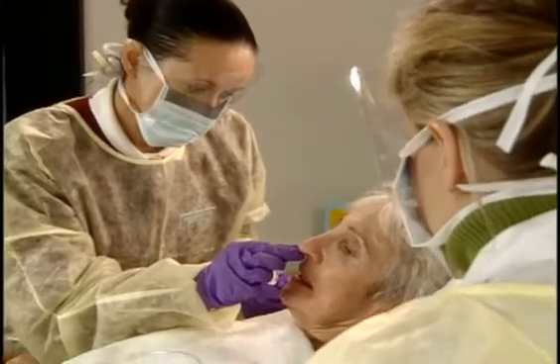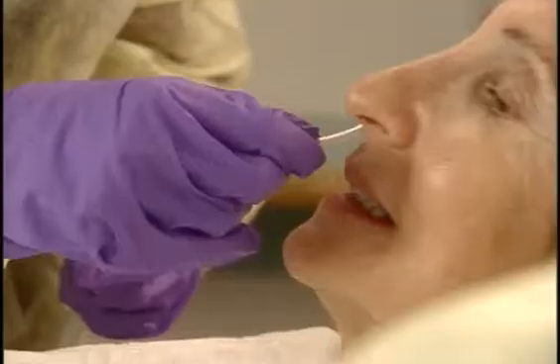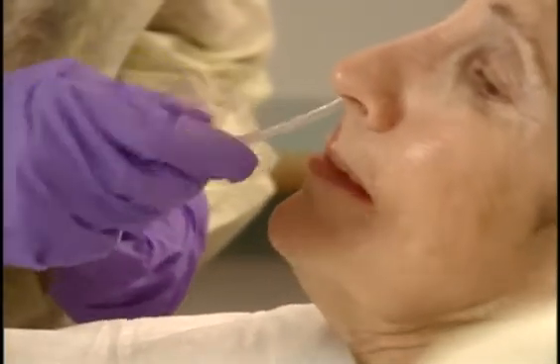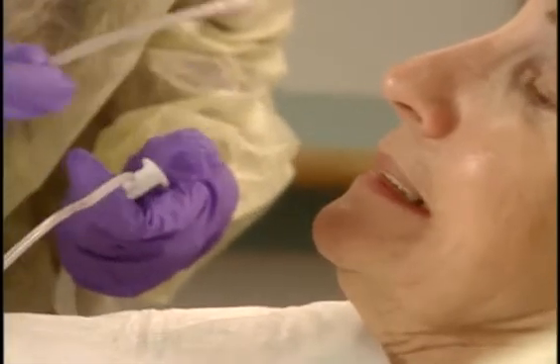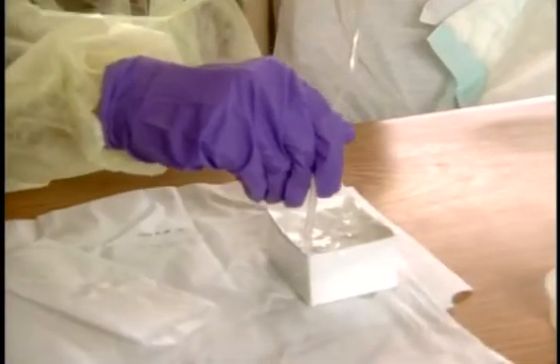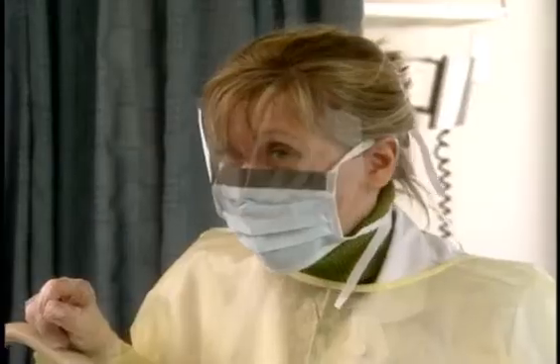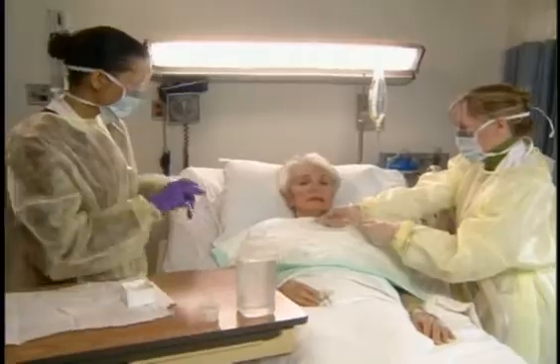Very good. Apply suction by occluding the Y port with your thumb on your non-dominant hand. Gently rotate the catheter as you withdraw it from the airway. Don't suction for more than 10 to 15 seconds at a time. Now I insert the catheter in the sterile saline solution to flush it. Very good. Repeat the suctioning procedure as needed to clear the secretions, allowing at least 20 to 30-second intervals between suctioning attempts. Okay, Mrs. Marconi, can you cough for me?